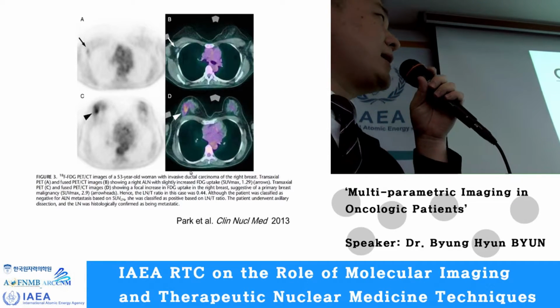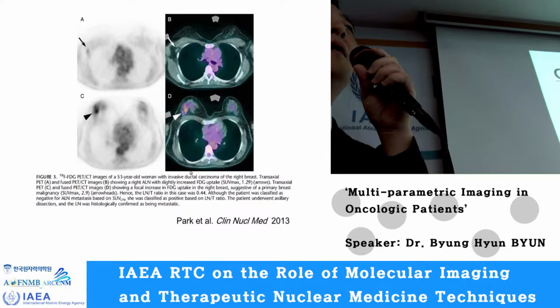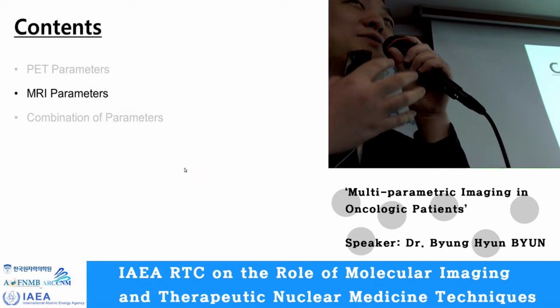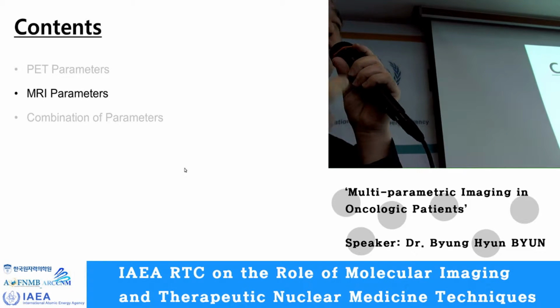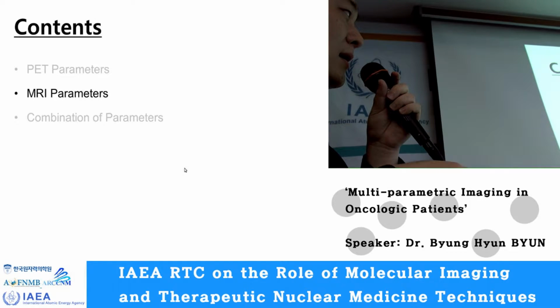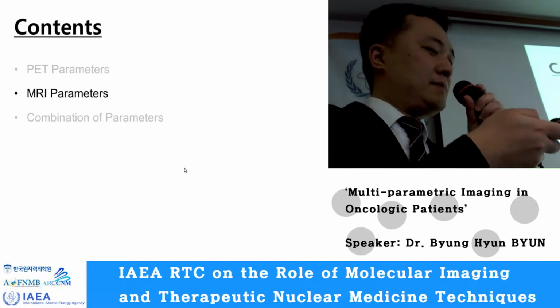I summarized some PET parameters and I will show you two MRI parameters, because there are so many MRI parameters. Then I will show you some examples of combinations of these parameters.